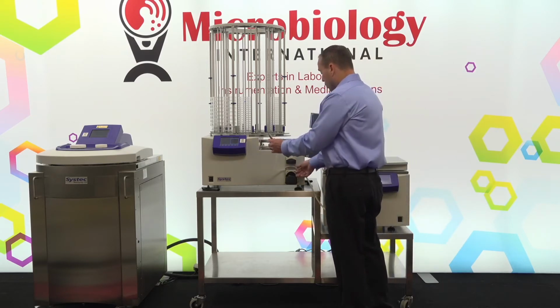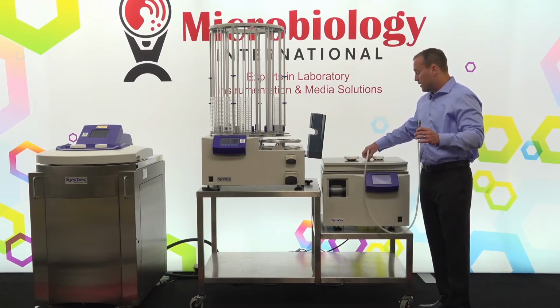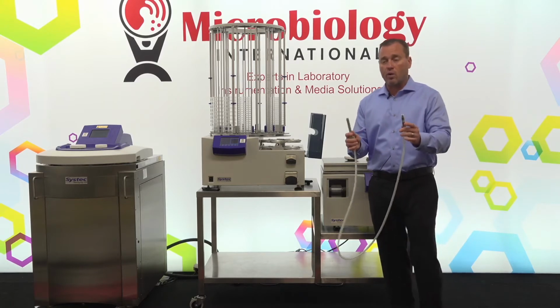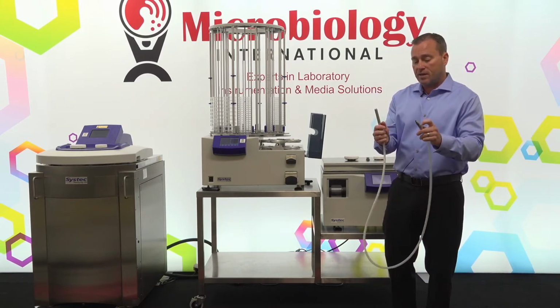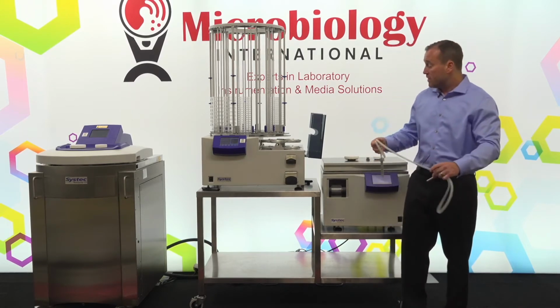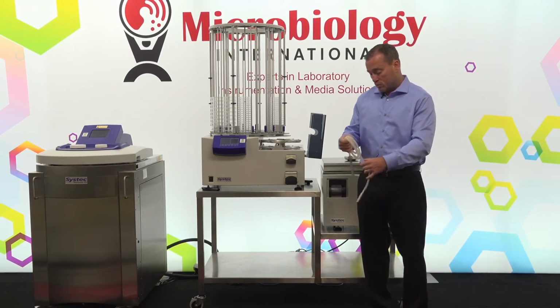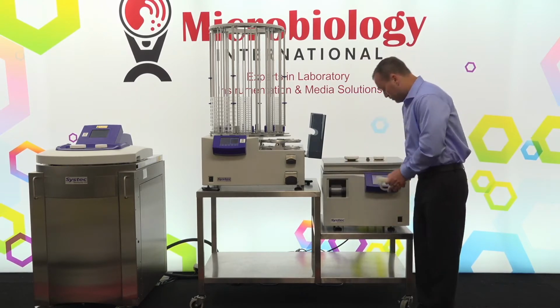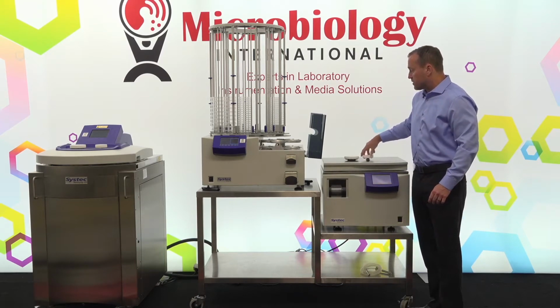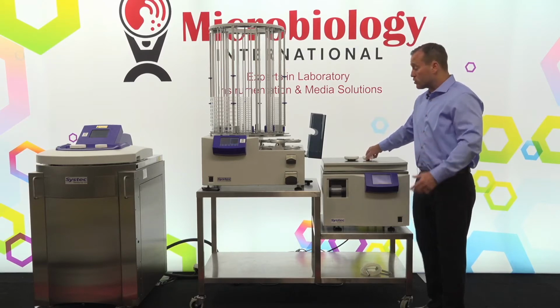For your tubing, you want to remove that after the cycle is complete, undo the tubing, then take it to a sink and make sure that you rinse this out really well. We don't want any solidified media inside of this tubing that would create hydrostatic pressure on the next cycle that would end up overshooting the plate that we have in the filling chamber. We'll close this down, and then I'm going to run through the cleaning process and the disassembly of this instrument, because again, it is very important to make sure that this instrument is clean for it to run correctly.